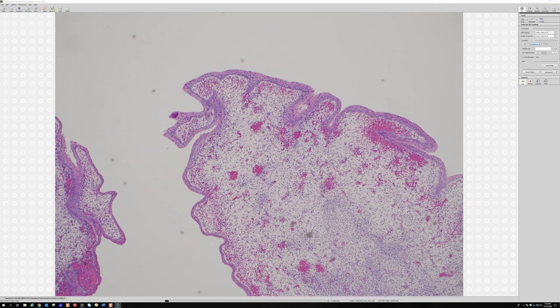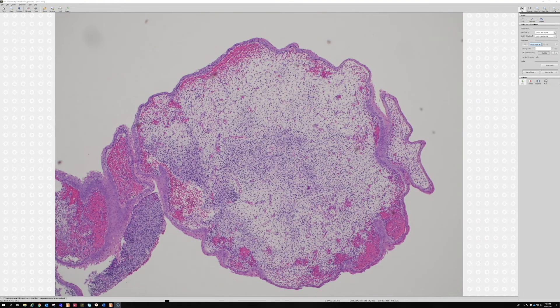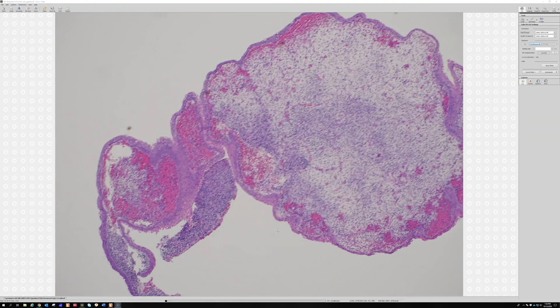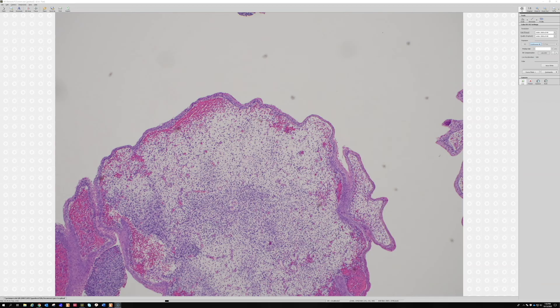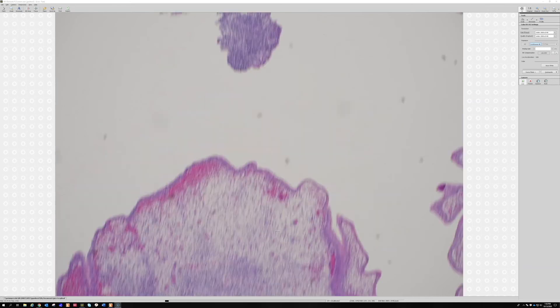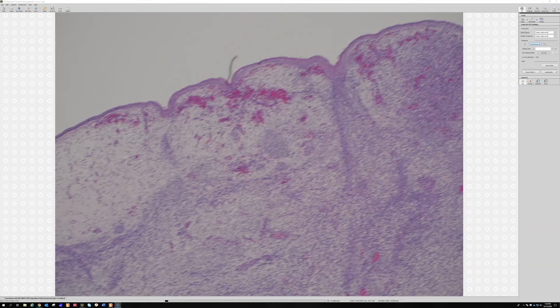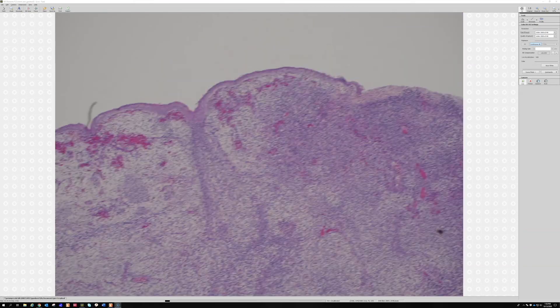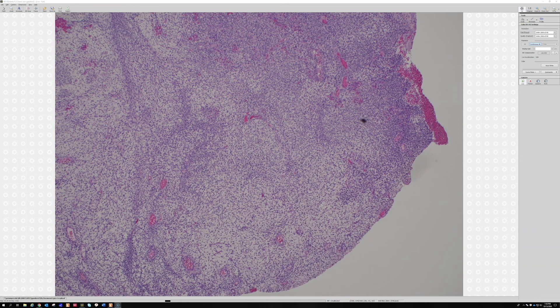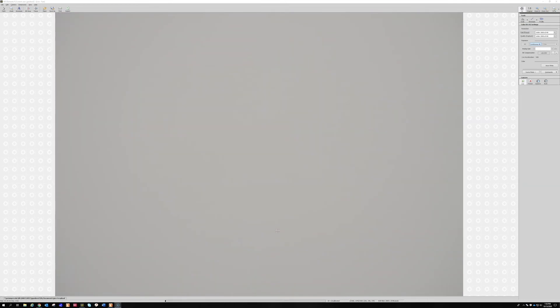This case was desmin positive and myogenin positive. My understanding is that these botryoid embryonal rhabdomyosarcomas have a really good prognosis overall. Pediatric rhabdomyosarcomas have specialized protocols and are handled by pediatric oncology, so I don't know all the treatment details, but what I've read is that this is usually good behavior. A very nice example to keep in mind.